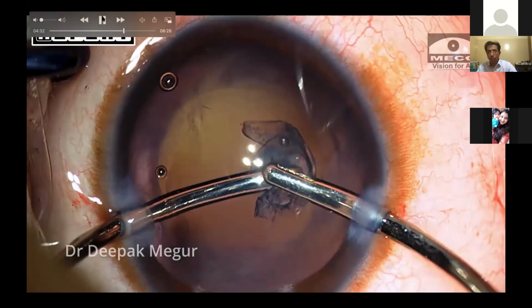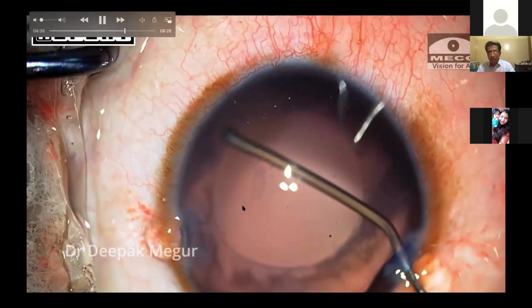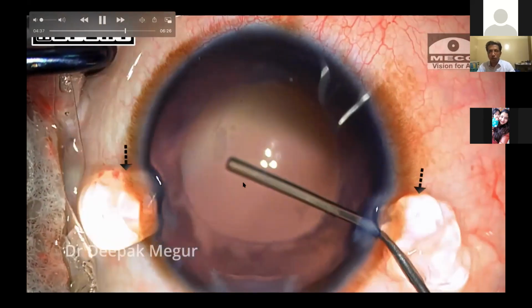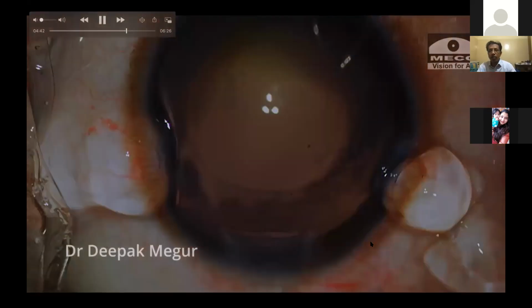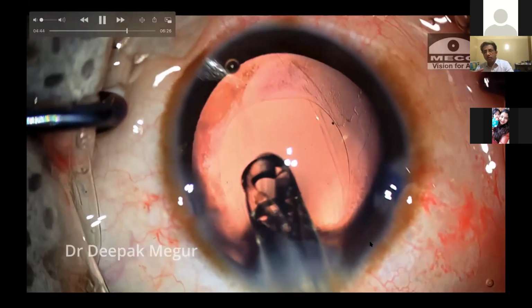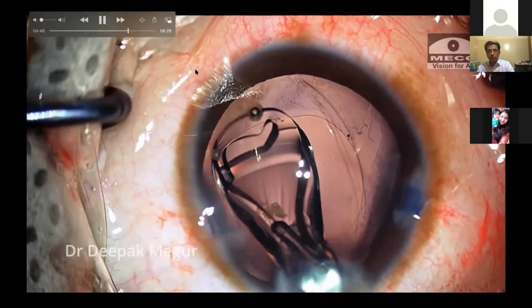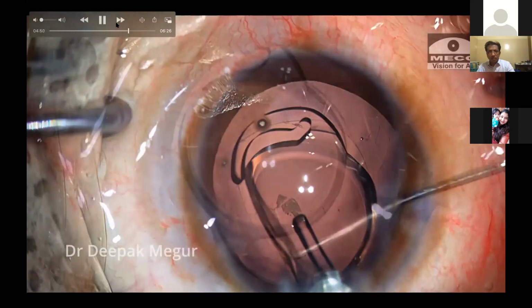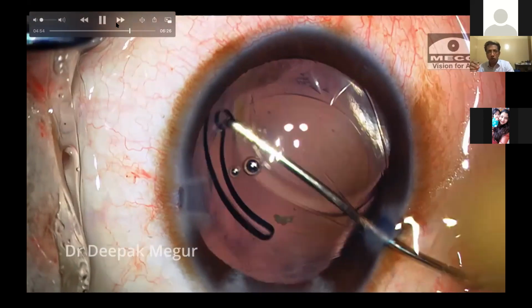What happened, the posterior capsule was all right all through. The amount of OVD which I injected into the bag was far more than what the weak posterior capsule could take. You can see I'm just using a little bit more OVD. That itself was responsible to just split the posterior capsule. Now, in this case, again, the anterior hyaloid still is intact. I was very sure about it.